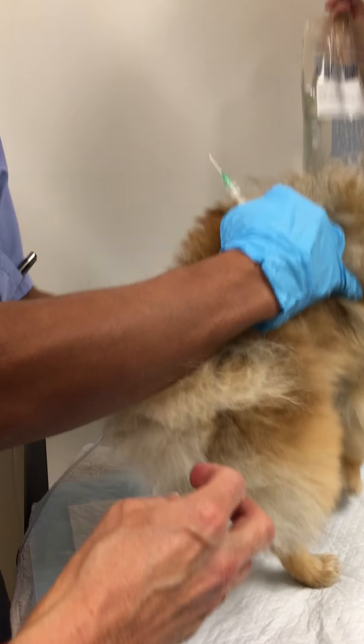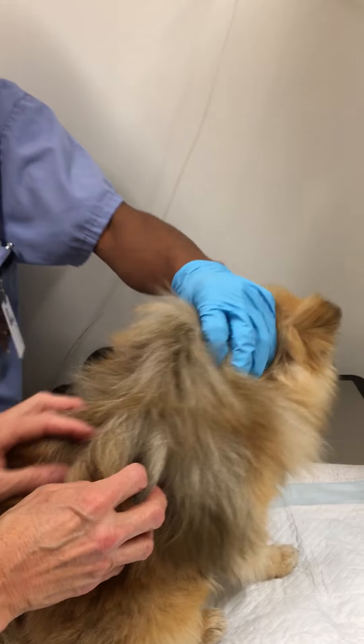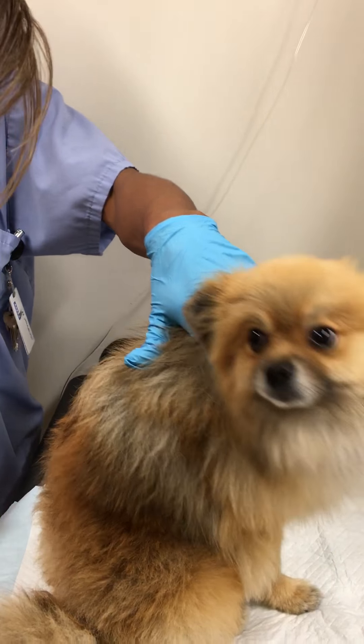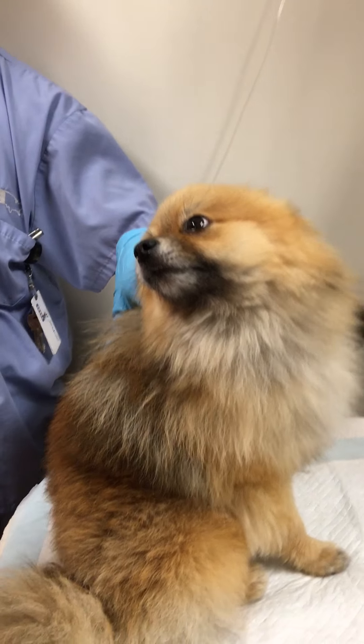Now hold on. This is tough. This is really tough. Aiden, what are you doing? Hold that back. Are you ready for me to hold it up? Yes, sir. Usually we have someone hold the head. And also, you didn't have to check for air bubbles or anything? Someone already did it. That's why. Who did it? You did it. You guys did it. I didn't do nothing.